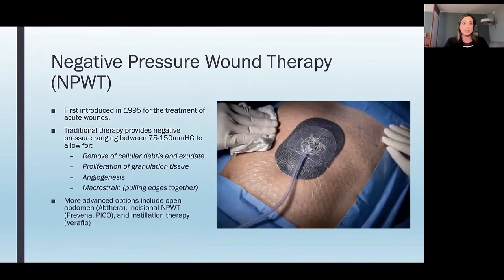There's a lot of growth in this space, so more to come, but definitely should get training if you're using negative pressure wound therapy. There's this new dressing which is featured, which is an all-in-one known as a peel in place that allows you to simply take the one dressing off, put it over the entire wound, no more cutting foam and things like that. So I think there will be a lot of advances in the next few years, and hopefully we can update this.